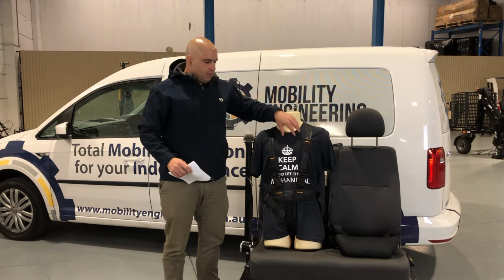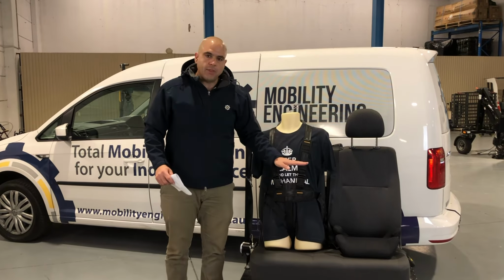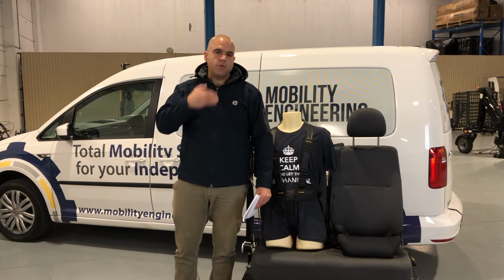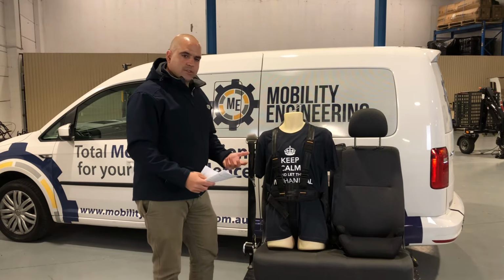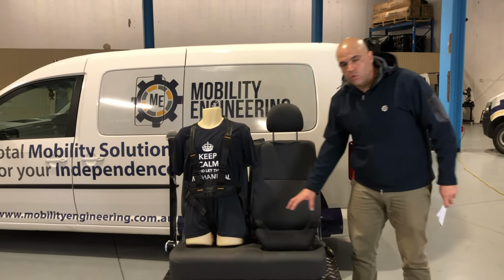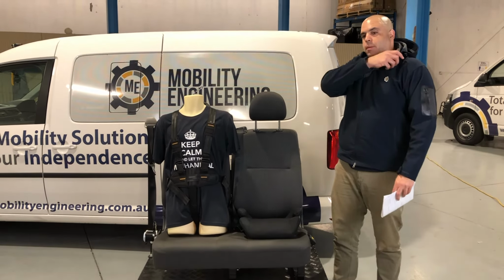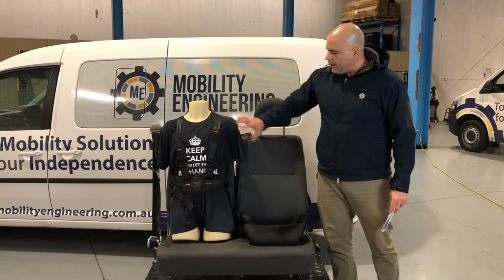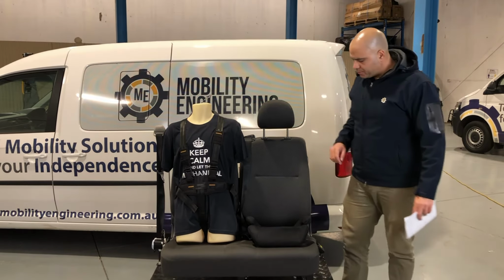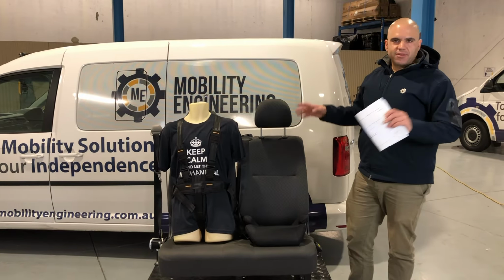The child prescribed the postural support harness is 6 years old, and she's only about this tall, so when the seatbelt comes onto the body, it actually hits her neck. So the OT has basically asked, are we allowed to use one of these under-bum cushions to raise the child up, to then bring the seatbelt around the shoulder and still use this harness? The answer is yes, but no. I'll explain.